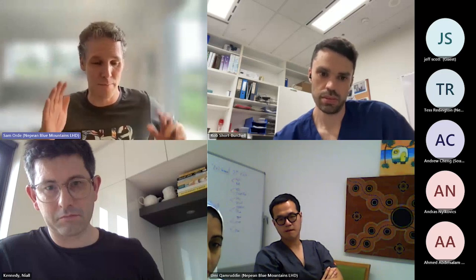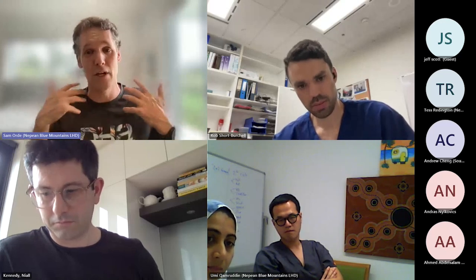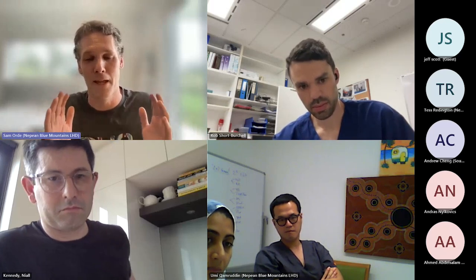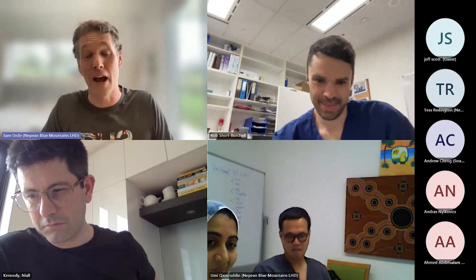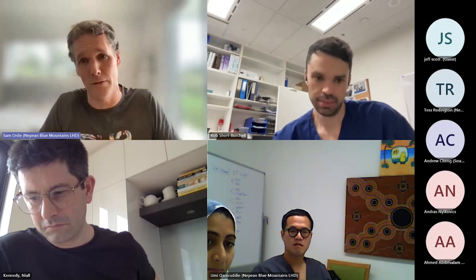And again, forgive me if I didn't say this earlier, I in no way think that echo should be the be all and end all in this. It's just another tool that you've got to look after these sick patients. And I reckon in maybe 1 in 10, it's useful. Most of the time you probably don't need it, but every now and then it's got me out of trouble, and particularly with those guys that I'm weaning from mechanical ventilation or I'm worried about giving fluid to.